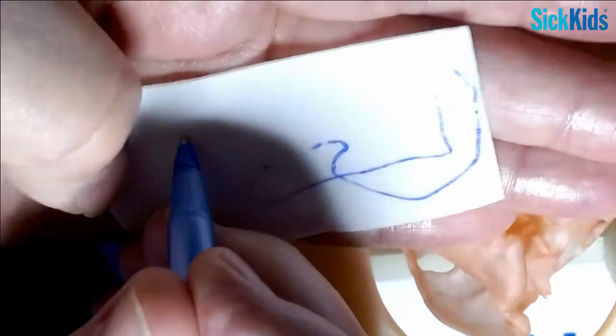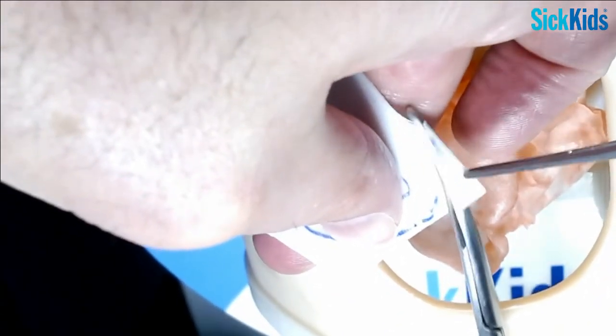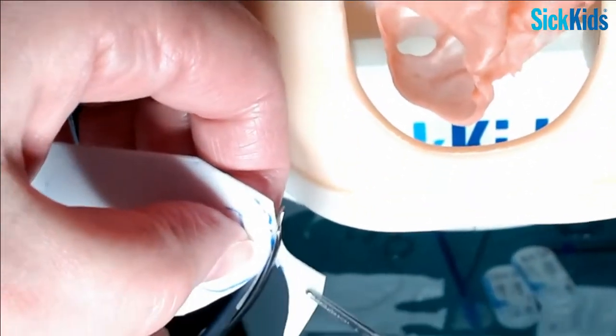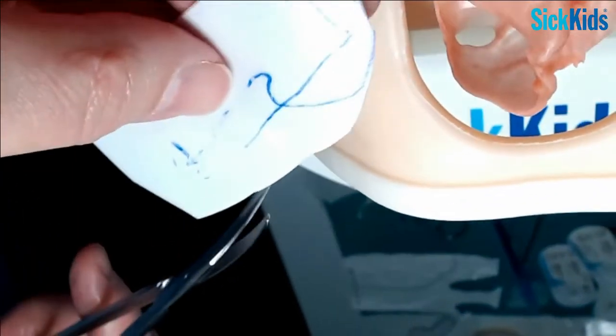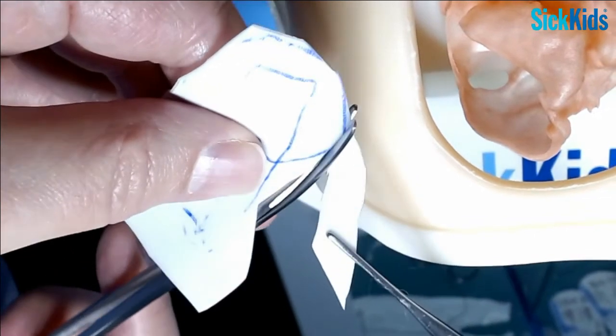So we've marked this up. We're going to build a patch as we go. Let's see what it looks like when we're done. Get some estimate of it. You have the 60C one? Yep. I'm going to take some of this off just so it's not too big, easier to work with.